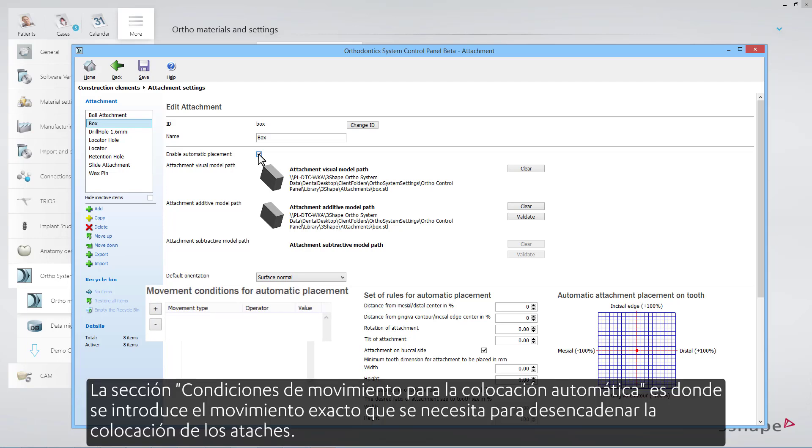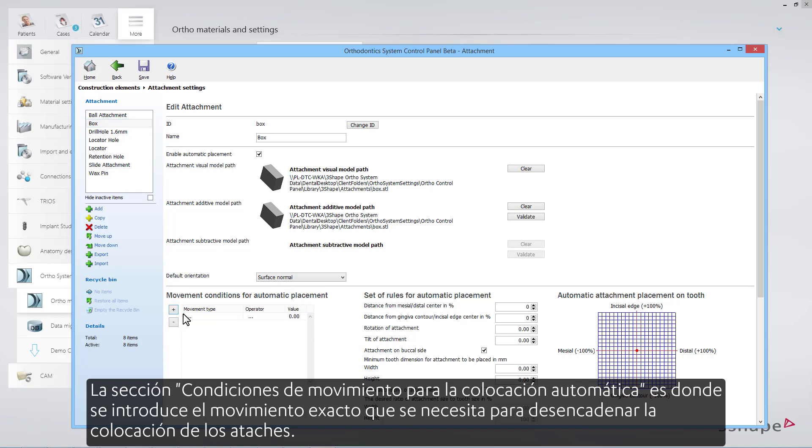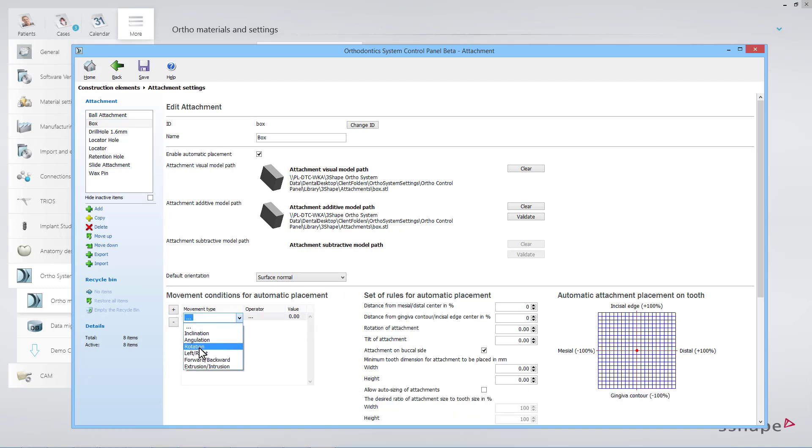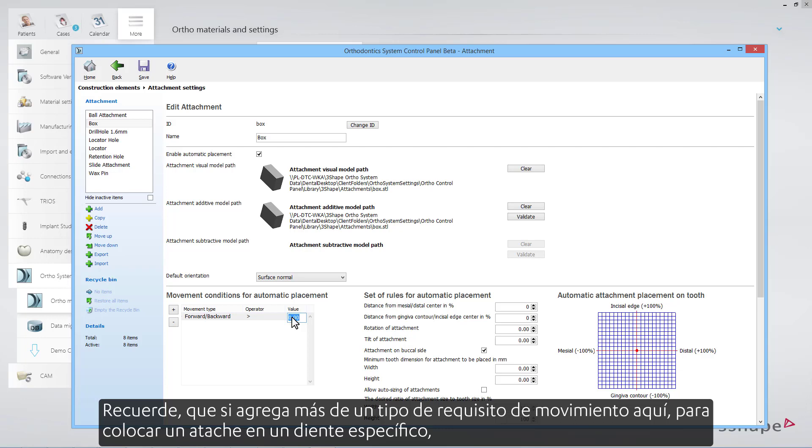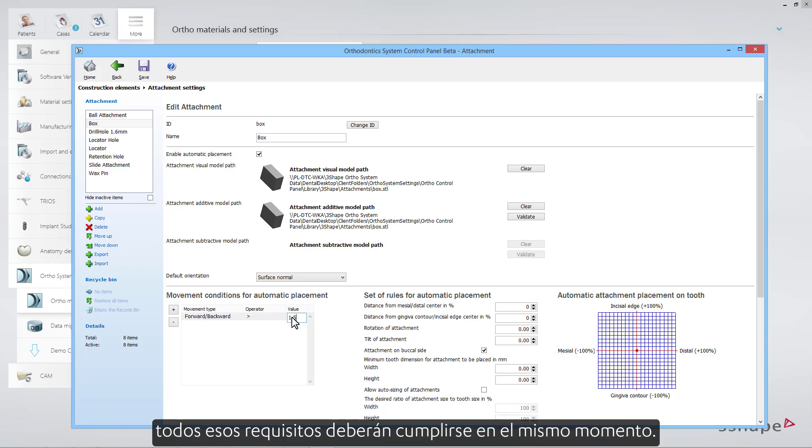The Movement Conditions for Automatic Placement section is where you enter which exact movement is needed to trigger the attachment placement. Please remember, if you add more than one type of movement requirement here, then in order to put an attachment on a specific tooth, all those requirements will have to be fulfilled in the same moment.